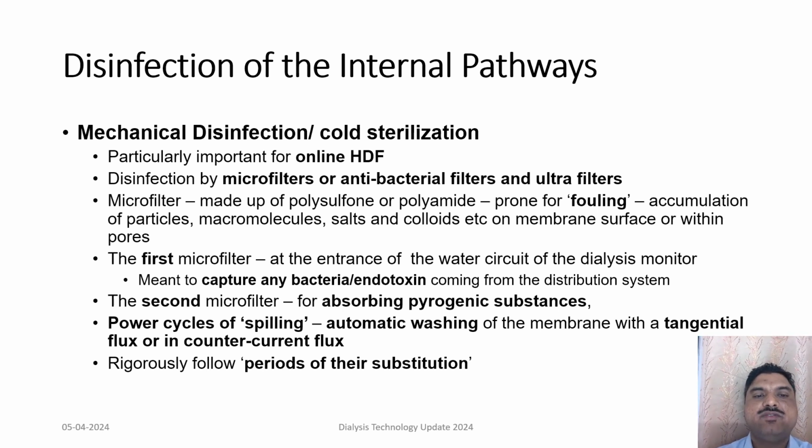One special method of disinfection is called cold sterilization or mechanical disinfection. It is particularly important in case we are using any online HDF machines. Here we use microfilters, also called antibacterial filters or ultrafilters. These microfilters are made up of polysulfones and polyamides, and because of these molecules, they are prone to fouling. Fouling means the accumulation of particles, macromolecules, salts and colloids onto their membrane surface or within the pores.